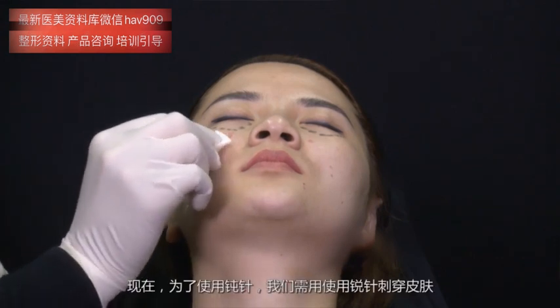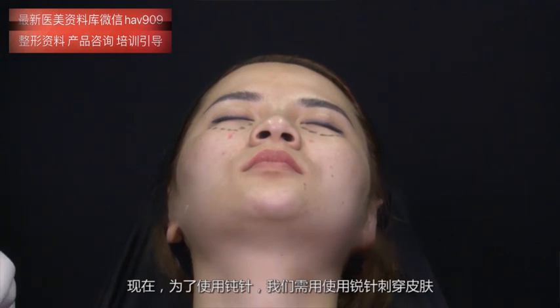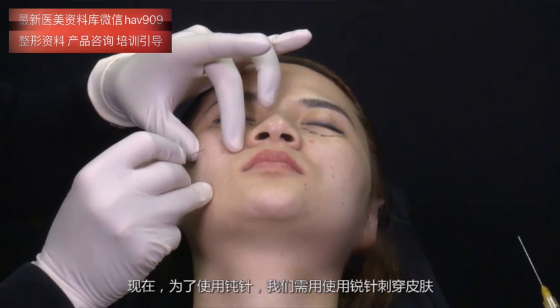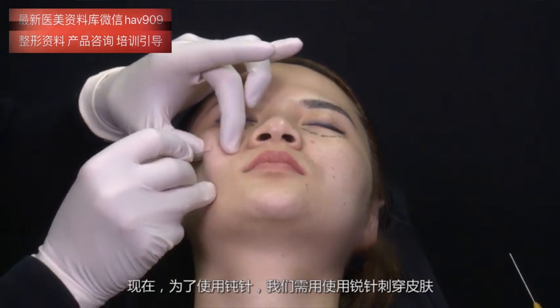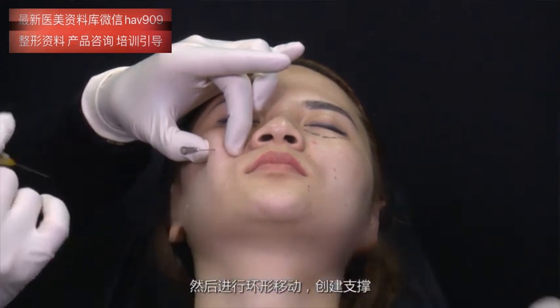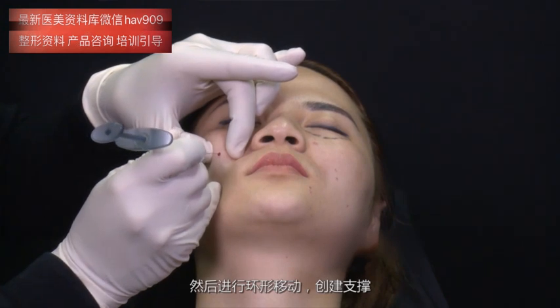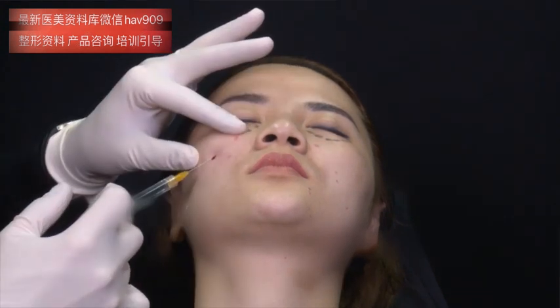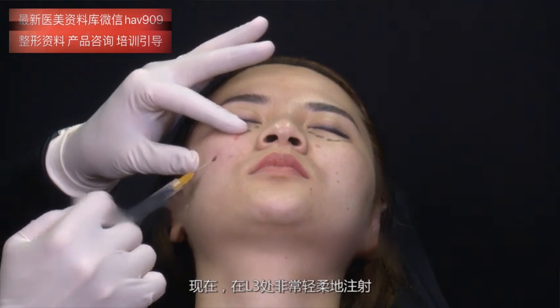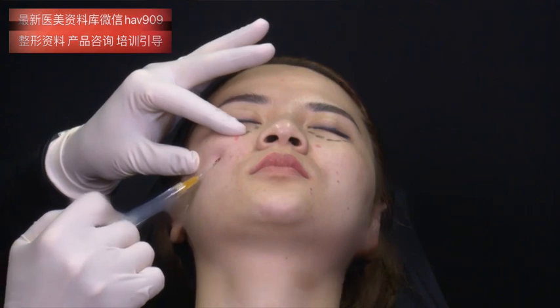Now, to work with cannulas, we need to enter with a needle and with a round movement create support. Okay? Now, very gently injecting in L3.